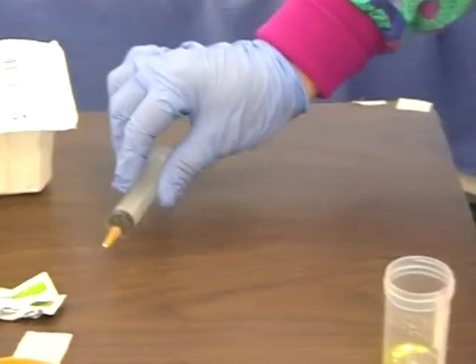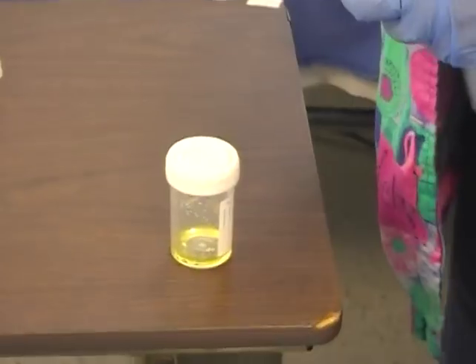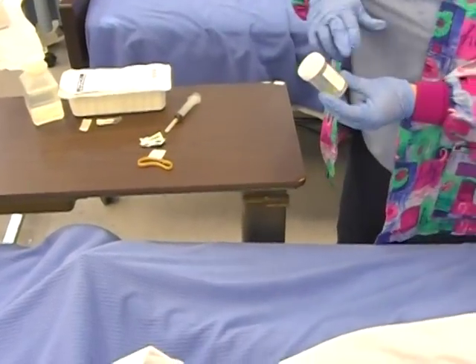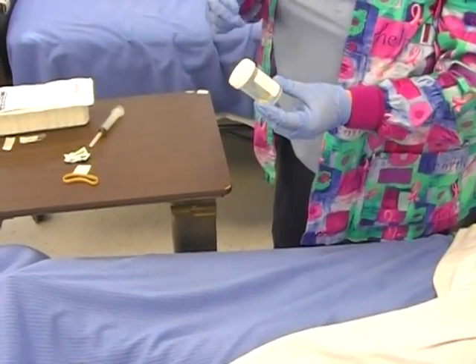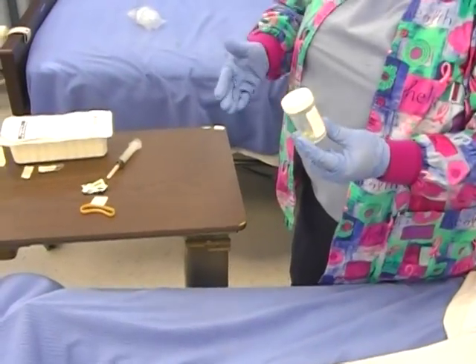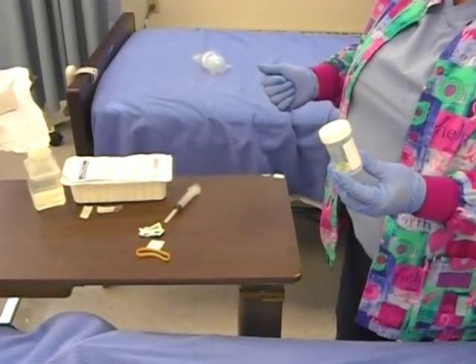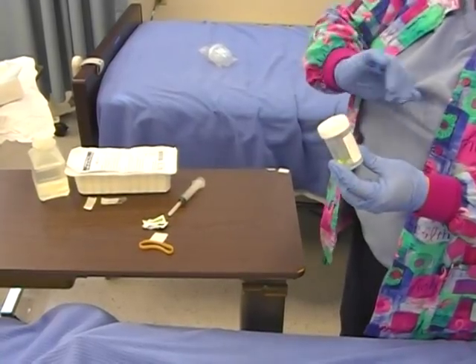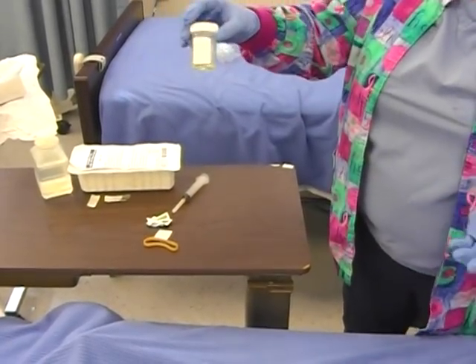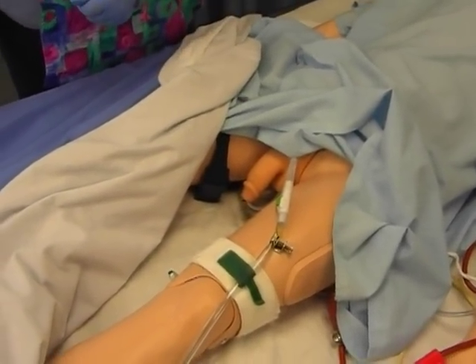Put the needle in the sharps container, then cap your specimen cup. As per the policy of your facility, label the specimen with the name, date, time, room number, doctor, and any instructions for the lab. This may be handwritten or some facilities have a scanned system where you scan the patient's band and it prints out a lab sticker that you place right on the cup — and the lab knows exactly what to do from the order in the computer. Then that gets sent to the lab. And that's how you do a urine specimen from a Foley catheter.